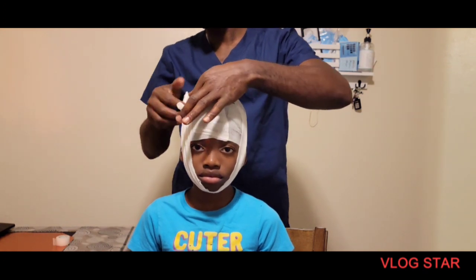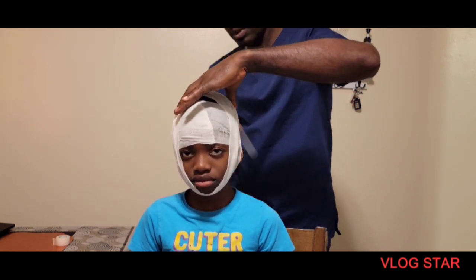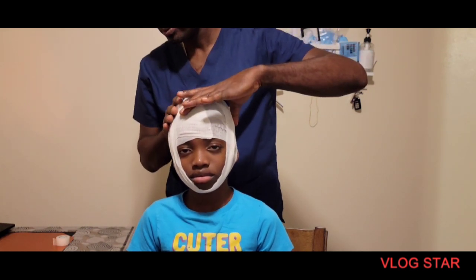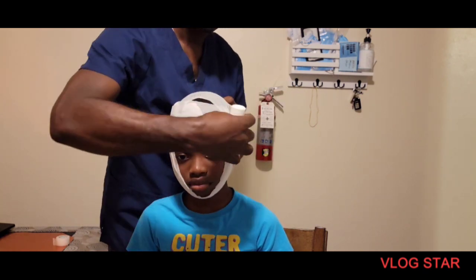So we twist the gauze, go around, secure it — we tape. And then we get a second gauze wrap and we start going around.